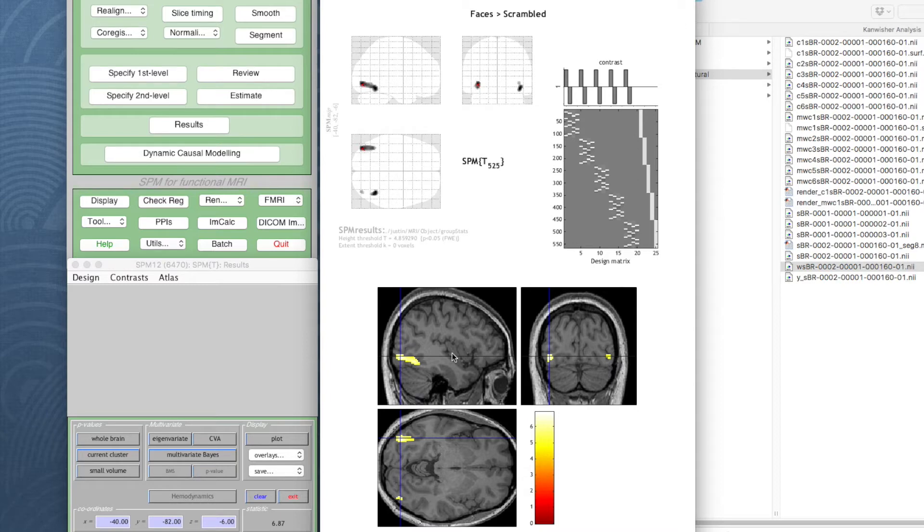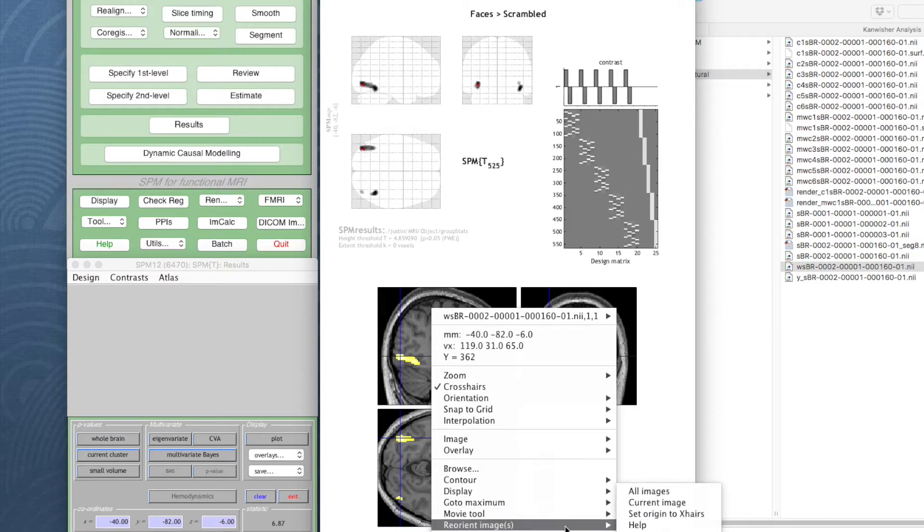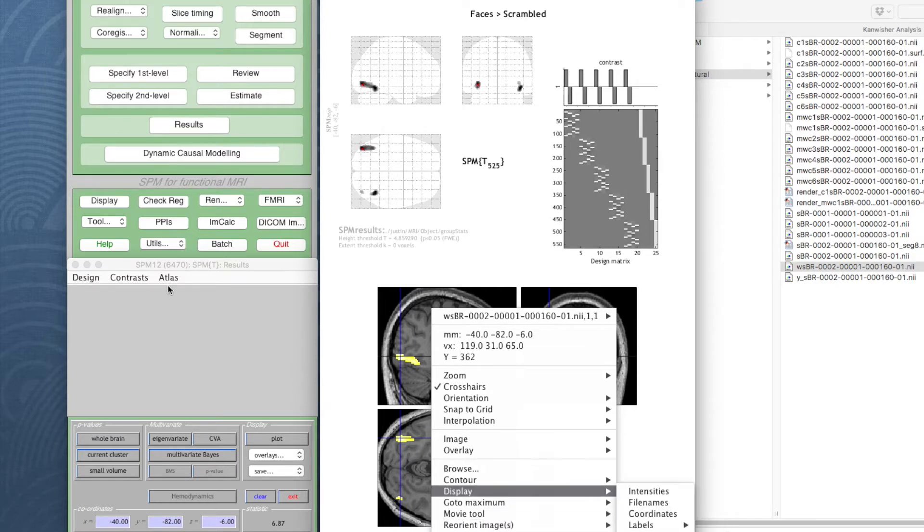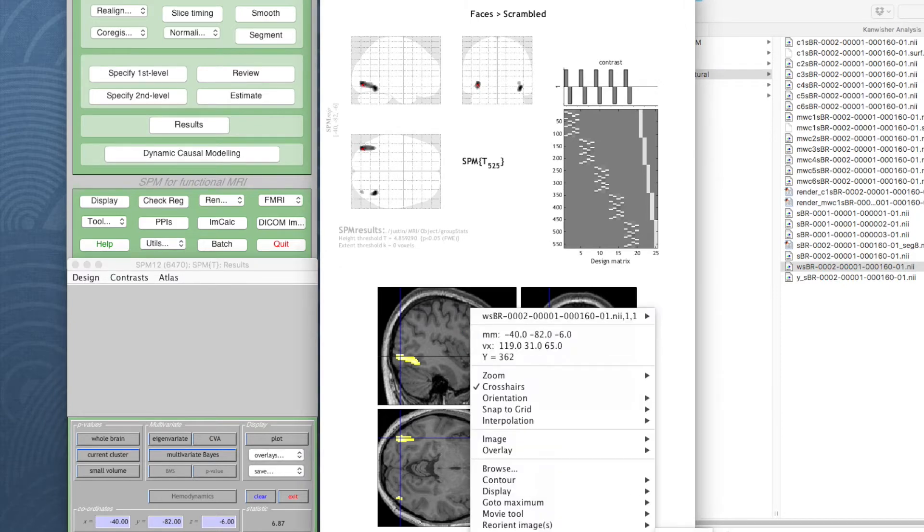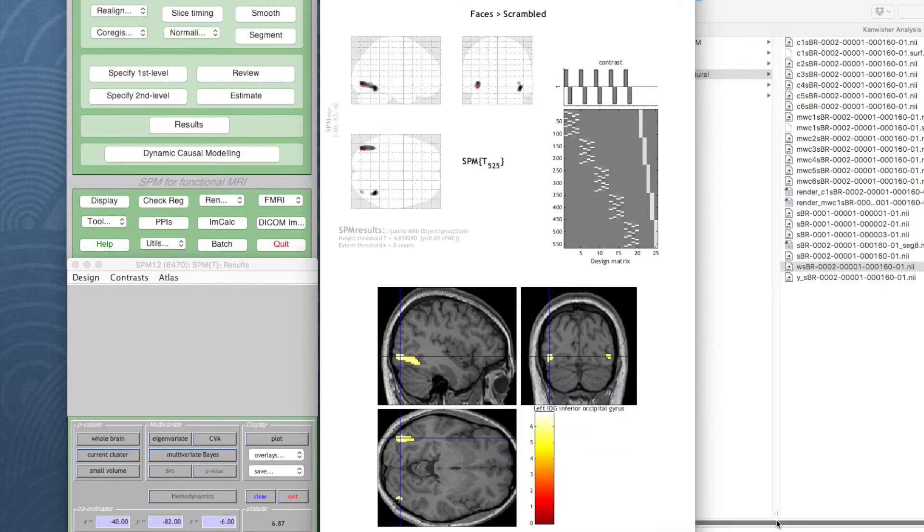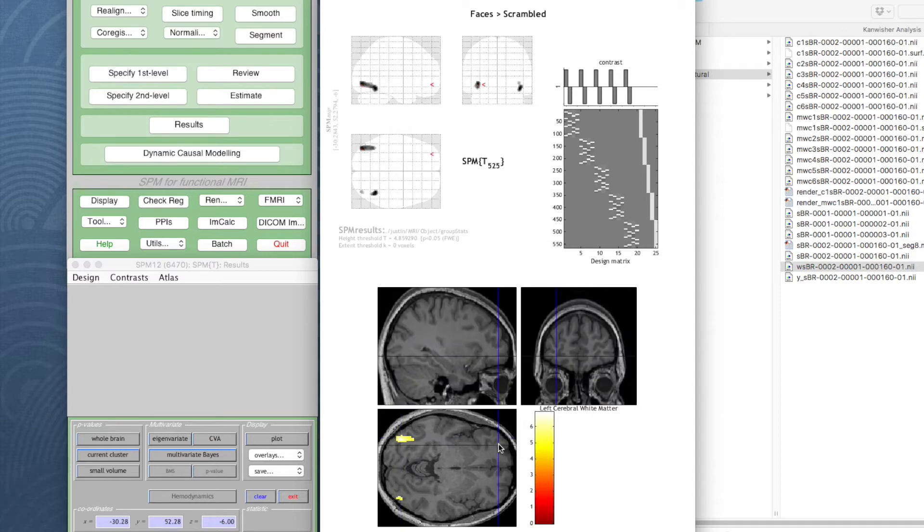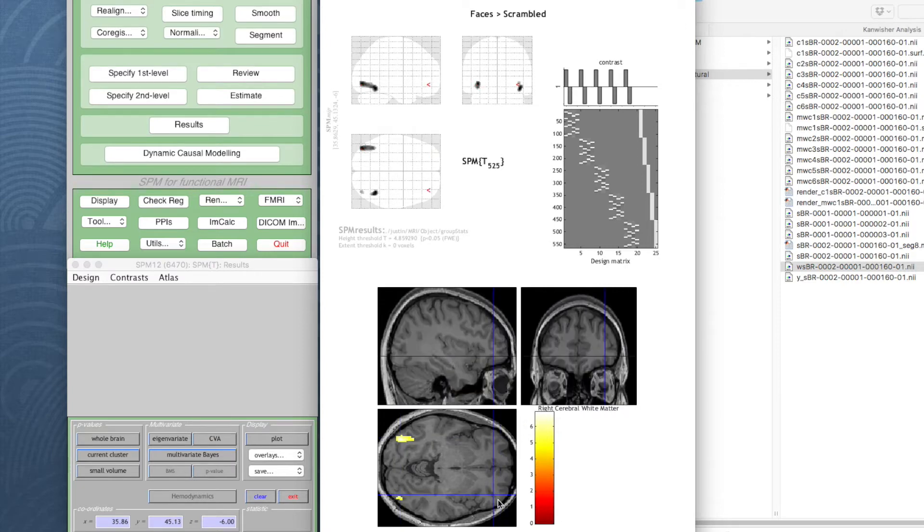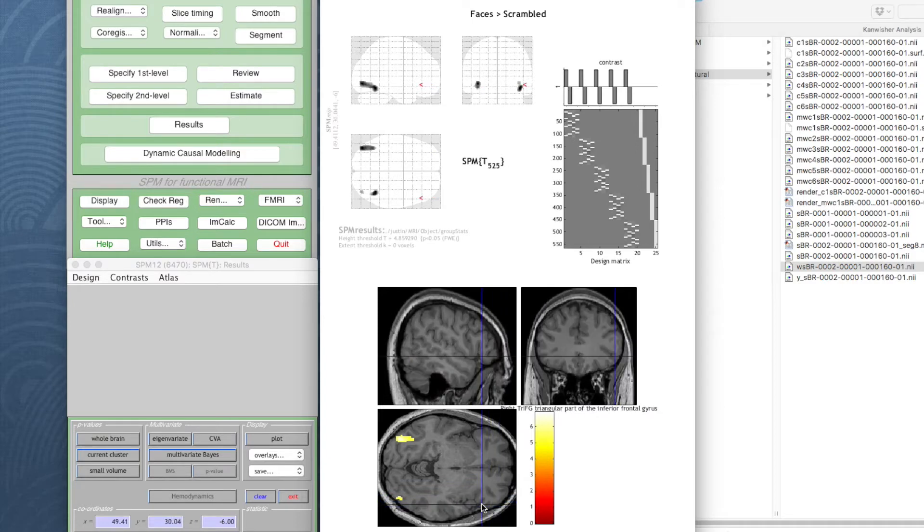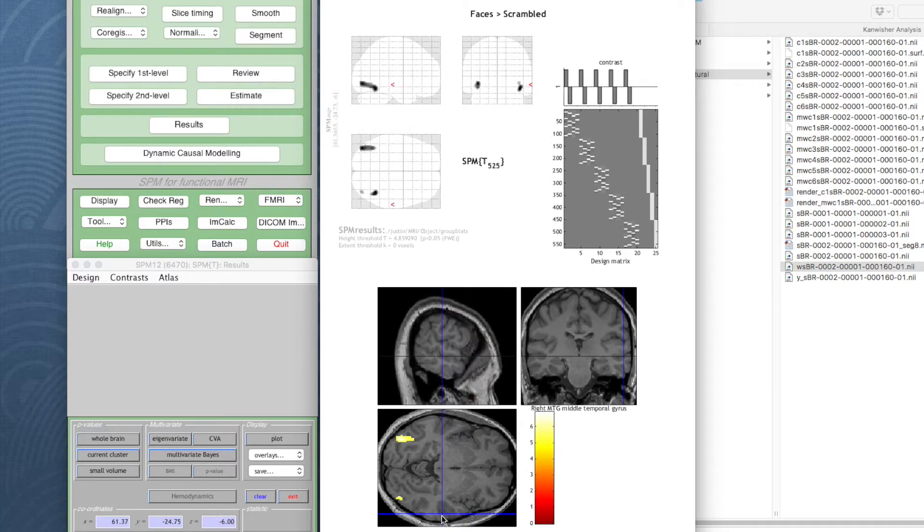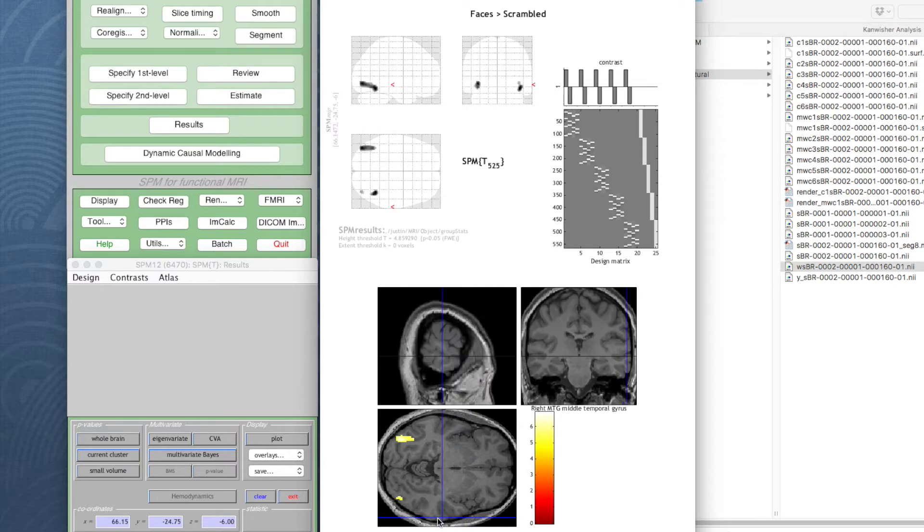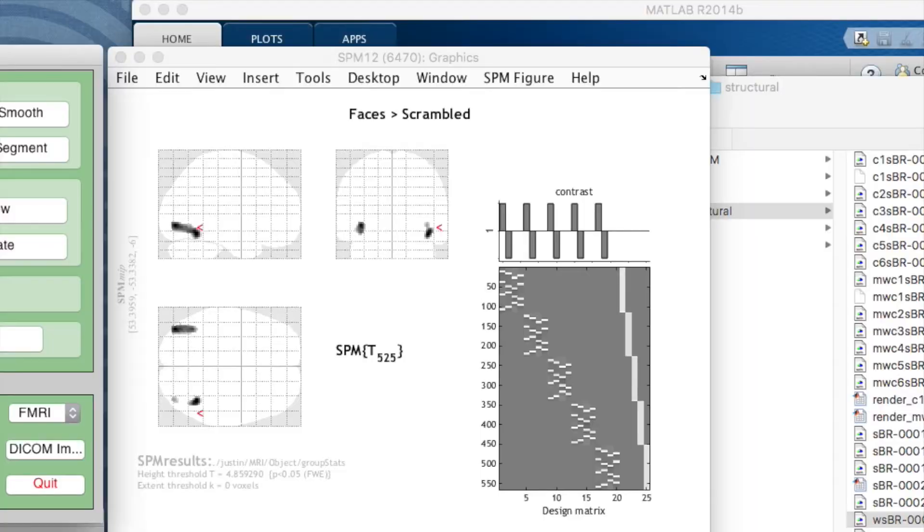What we can even do here is use neuromorphometrics, and now when we do this we get to display labels. We just get a little text saying where we are, and it's quite good to click around someone's brain and get an approximation of where we are. It's quite good for learning neuroanatomy as well, but there are all these caveats - this is approximate based on lots of people. Before we go much further with this I want to create an average image, so I'm going to press the ImCalc button.